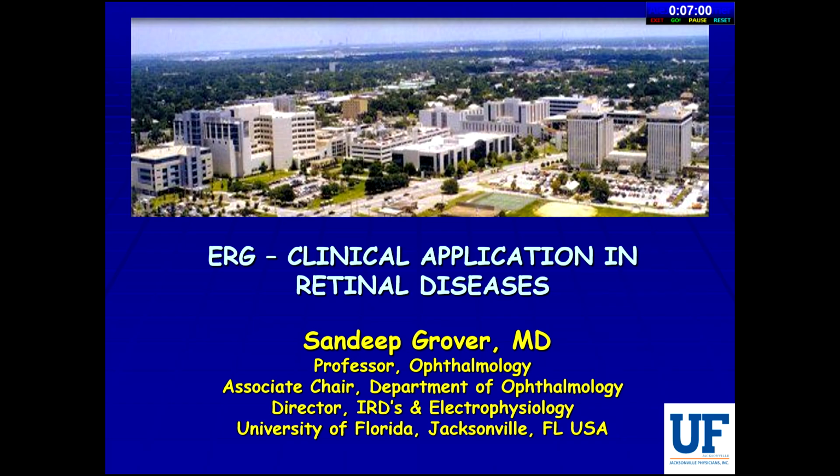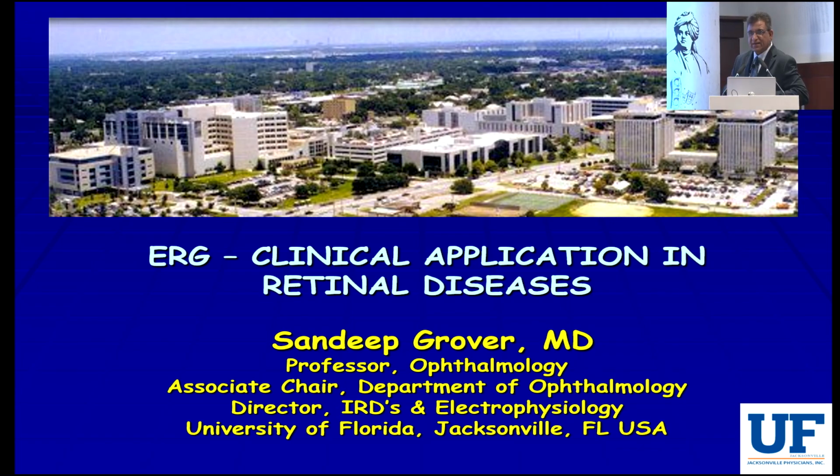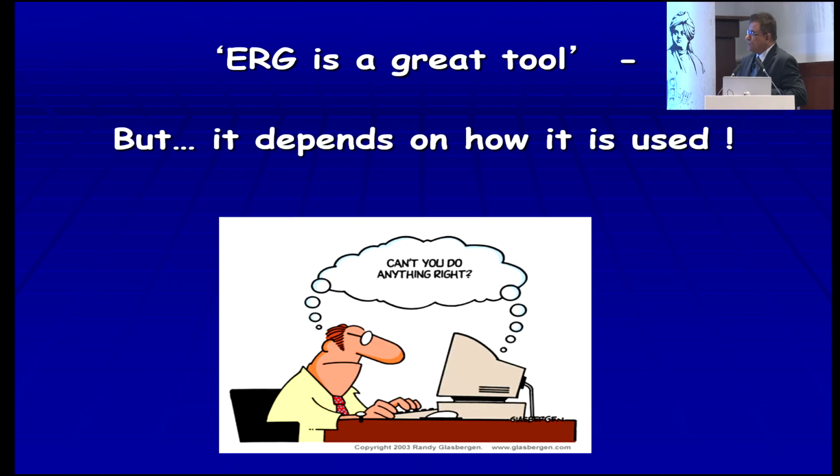Thank you very much to the scientific committee for inviting me. Can you hear me at the back? Okay. So we're going to talk about a very dry topic that was at the end, which is the ERG. Just curious how many of you in the audience actually interpret an ERG. Okay, great. These are my financial disclosures, but there's no conflict of interest in today's talk. So ERG is a great tool, but it really depends on how it is used.